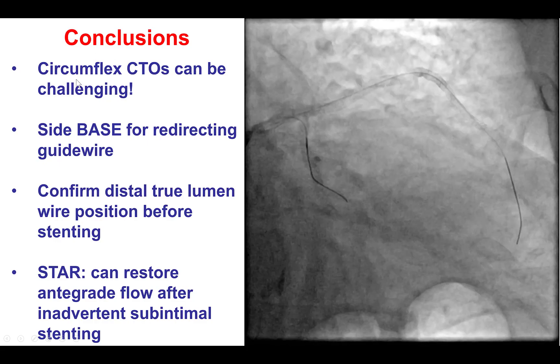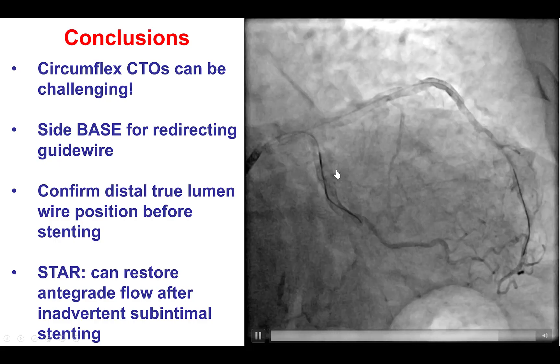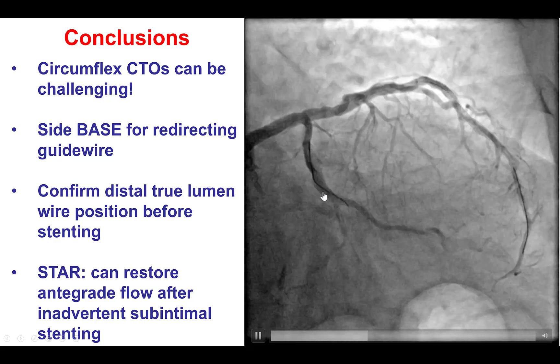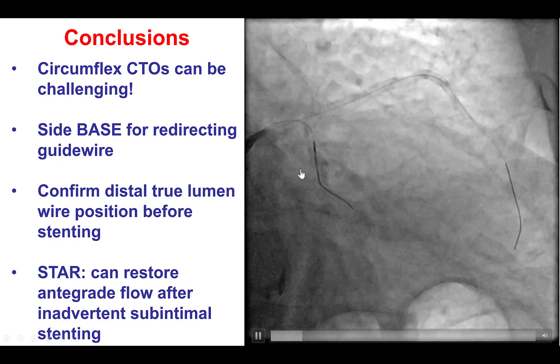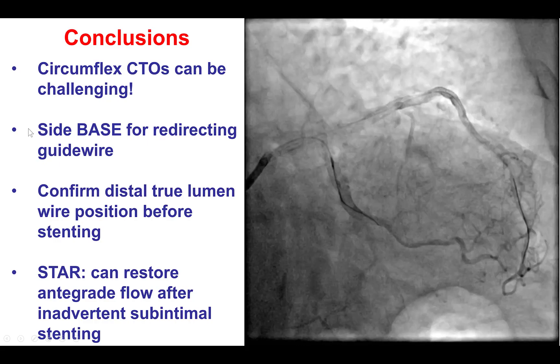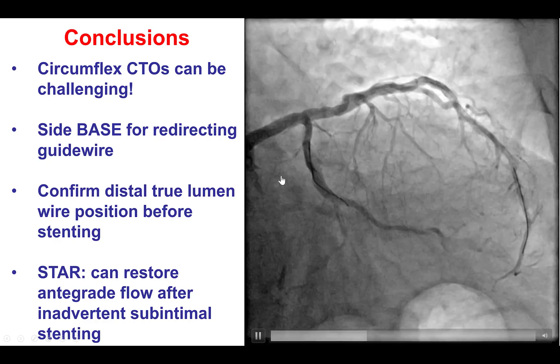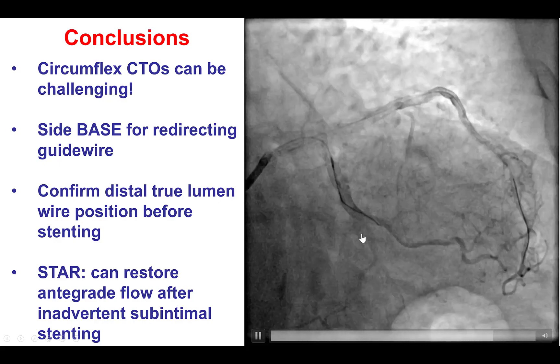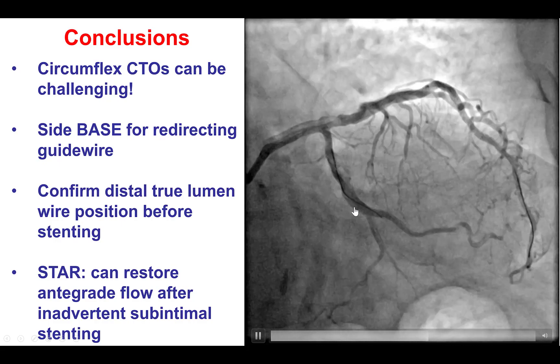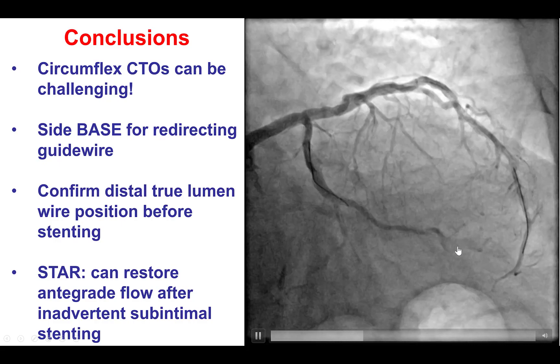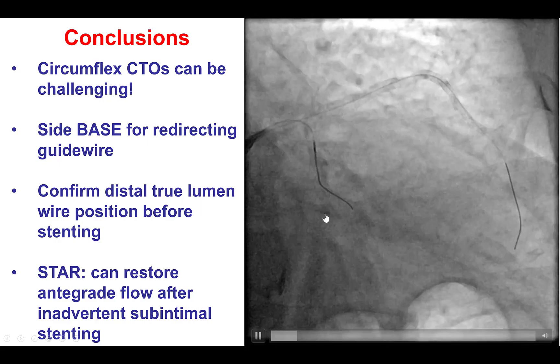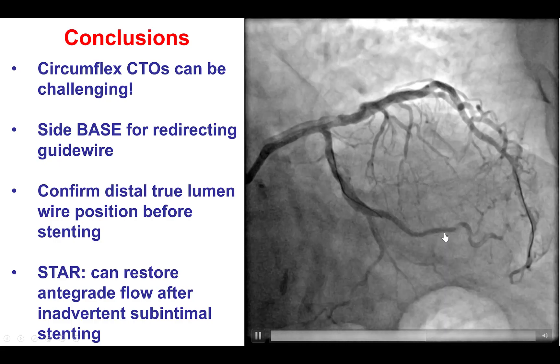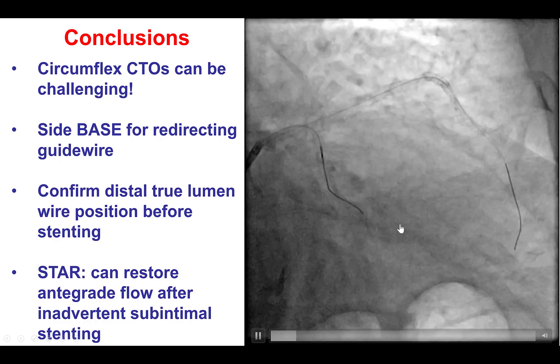Multiple lessons from this case. First, circumflex CTOs can be challenging — there is often significant tortuosity that is not always easy to appreciate on the angiogram. Here, the wire entered into an inferior branch, and we used the side-base technique, essentially inflating a balloon halfway in, halfway out, and advancing another wire into the course of the vessel. We used the stick-and-swap technique and thought we were in the true lumen; we even transduced pressure through a microcatheter which appeared arterial — but in this case we were wrong and were still in the false lumen, or the extra-plaque location.